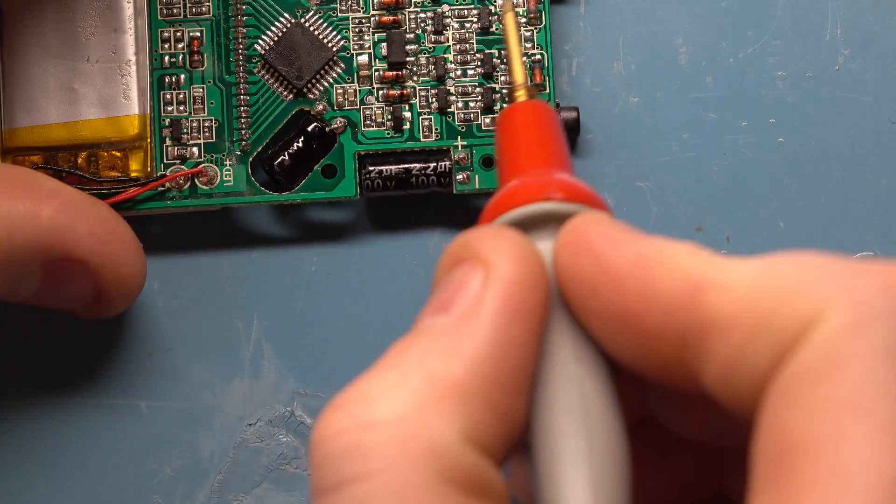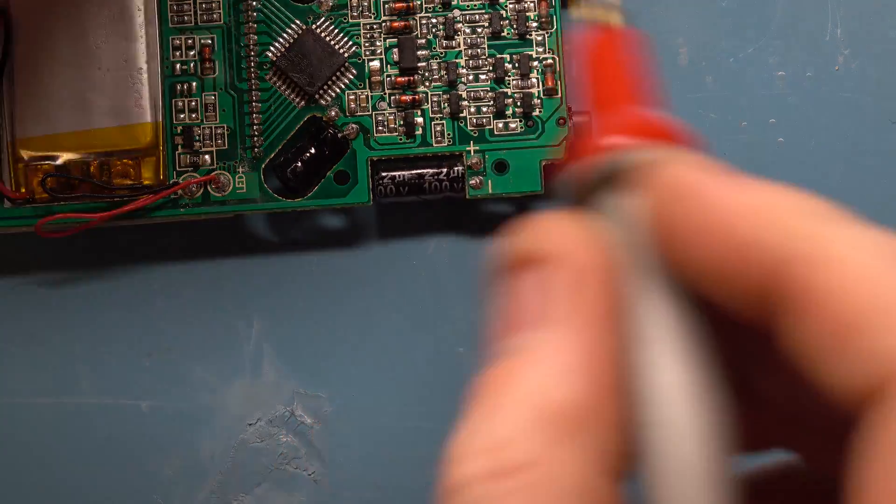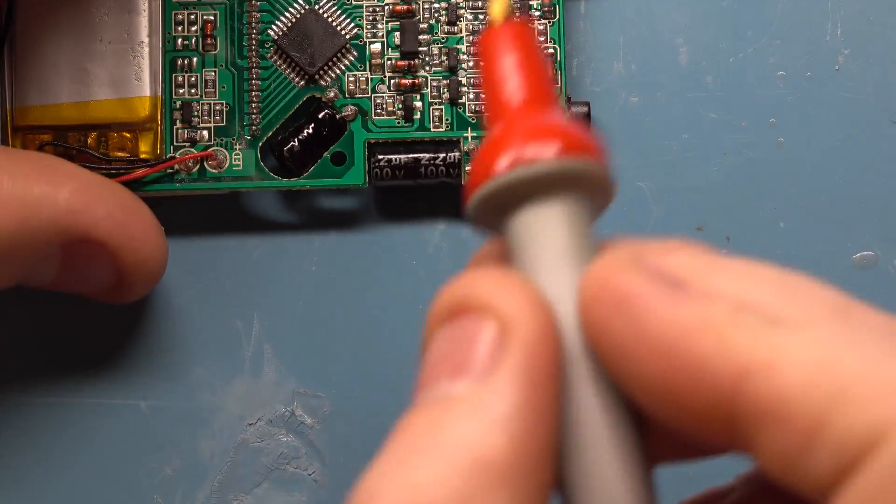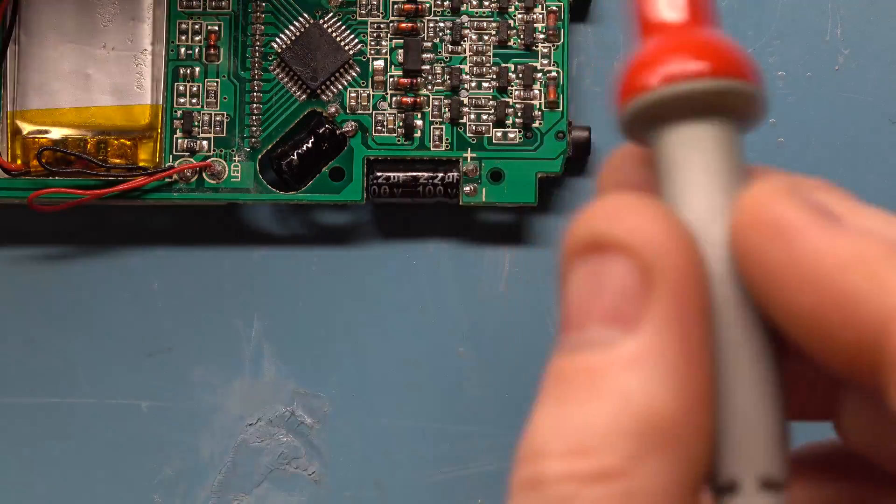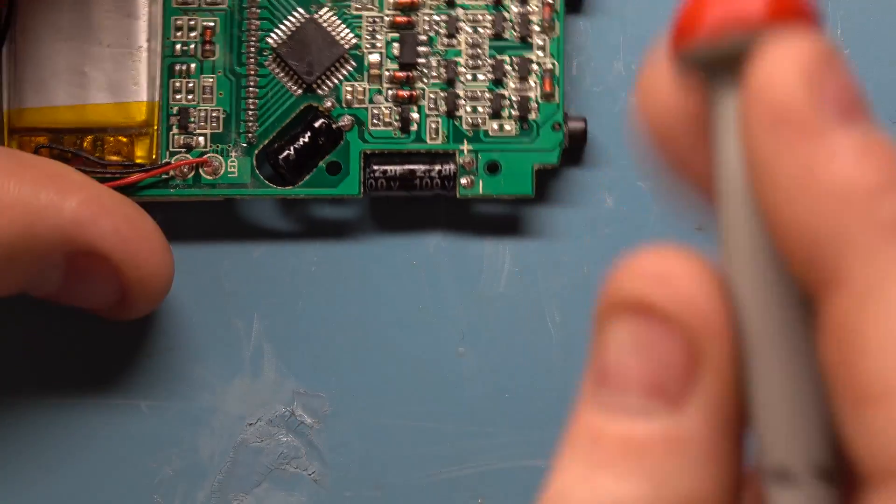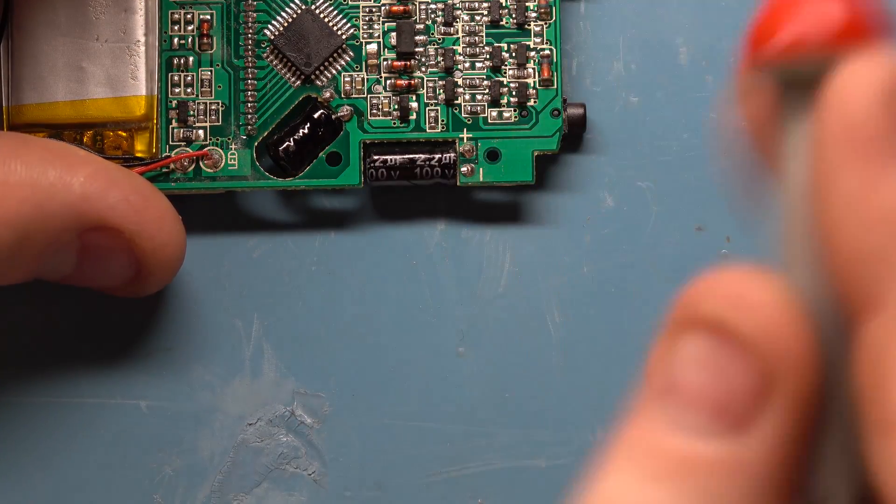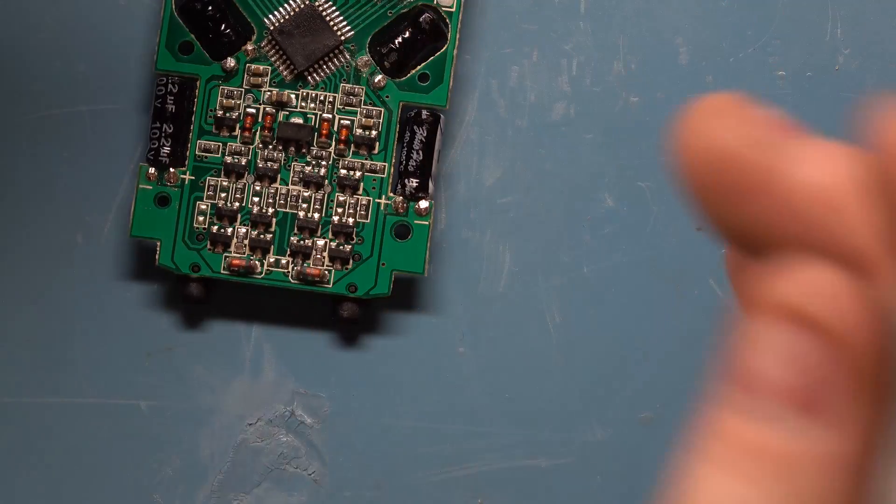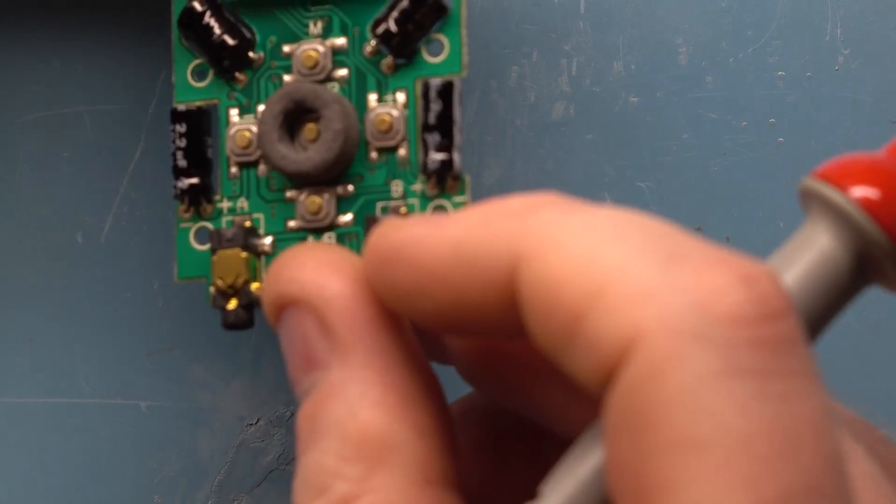And then this circuit down here is like a motor driver, like an H-bridge, which is turning the high voltage DC into alternating current. So that's why we saw those square waves on the scope. Yeah, all in all it's a pretty simple circuit.